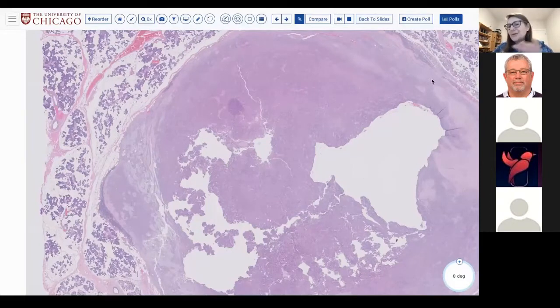And yes, I'll give you tables on mutations in a bit. HRAS mutations are present in epithelial myoepithelial carcinoma de novo, but generally epithelial myoepithelial carcinomas ex PA still retain the PLAG type of rearrangements that you see in pleomorphic adenoma. So I would argue that for pleomorphic adenoma and carcinomas ex PA, the genetics generally tend to be the same. So the genetics are less helpful in distinguishing benign from carcinoma ex PA. To me, it's more the morphology. And this doesn't have, as I said, that infiltrative morphology.